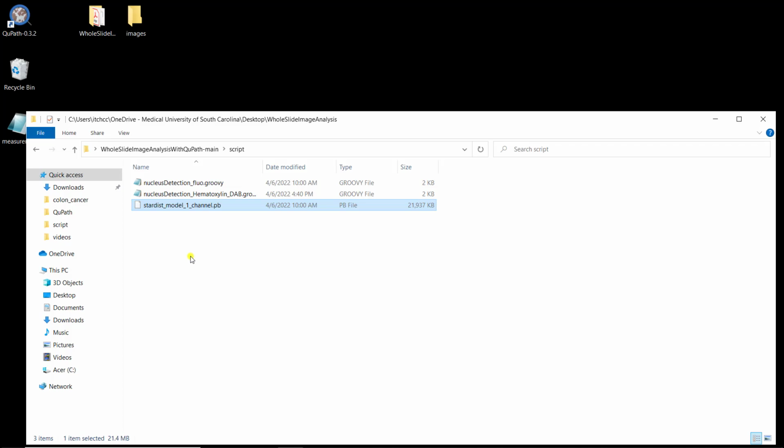They also introduce another model, which is Mesmer. But here I used their data to train the Stardist model. I also used two other papers I wrote, where we had polyp data that was annotated and intestinal epithelium of mice that was annotated. I put all these data sets together to train a Stardist model to obtain this model, and these are the scripts.